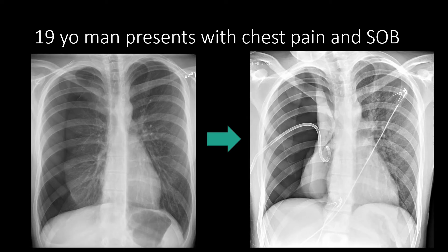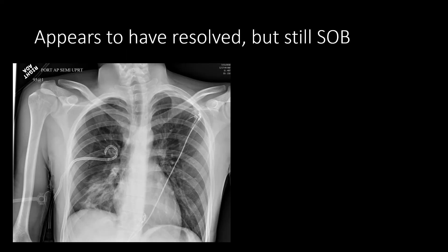A leak was found in the chest tube system, and after the patient was placed on appropriate suction, a repeat chest radiograph showed marked improvement of the pneumothorax. There is maybe a little residual pneumothorax, but it's substantially smaller than it was prior to treatment. Note that this is a semi-upright radiograph, which may underestimate the size of the pneumothorax. The patient has also developed an airspace opacity, which could be related to re-expansion pulmonary edema or residual atelectasis.